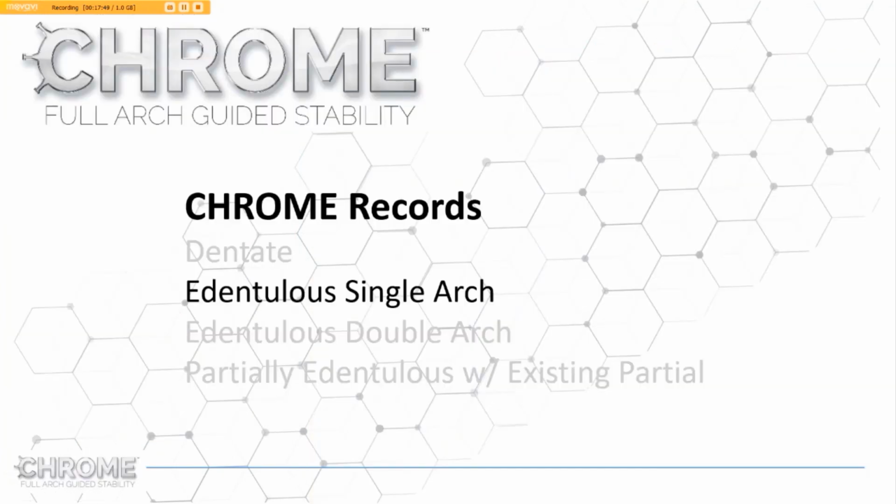So those were all dentate cases, and there are many more types of situations that can present. We always recommend sending in the casts with a request, or simply take some photographs and send them to us, and we can have a discussion about what records are needed for a particular case. And in those situations where we just have photos, things can be expedited.